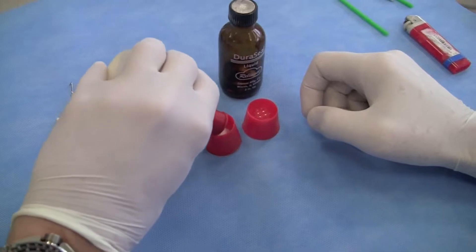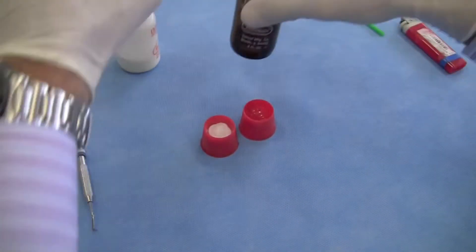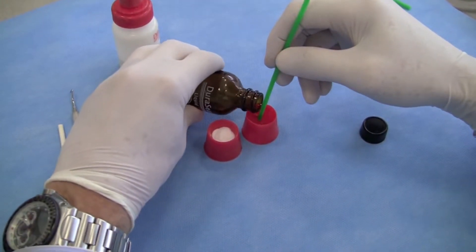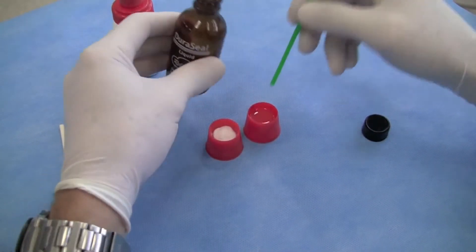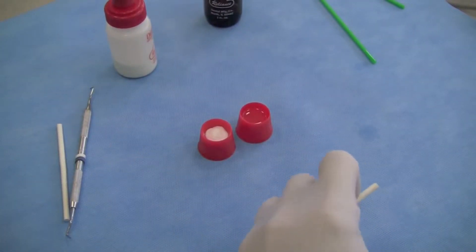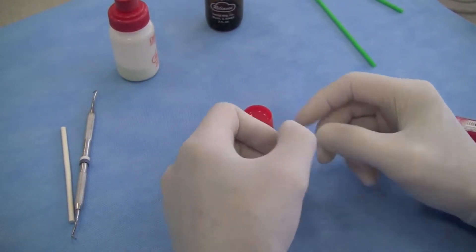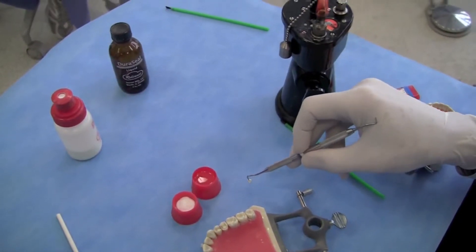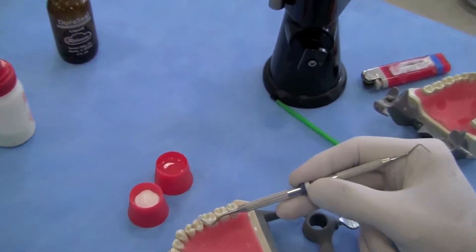We'll dispense some of the product. Don't be too conservative — go ahead and start with a large amount. It's a very inexpensive product. It's helpful to cut the Gutta Percha into small segments, which can be done with scissors or a scalpel. I usually have my dental assistants prepare small pieces and keep them ready.